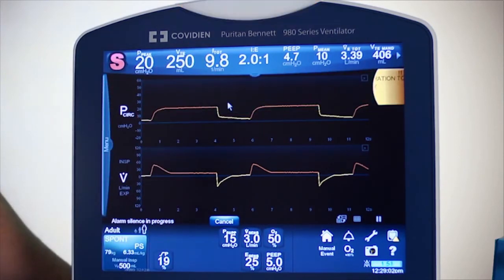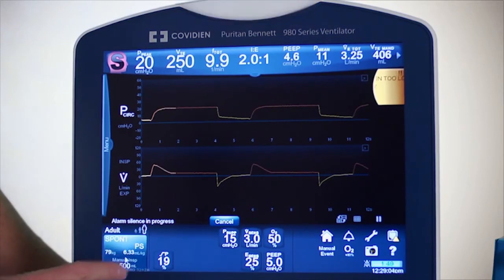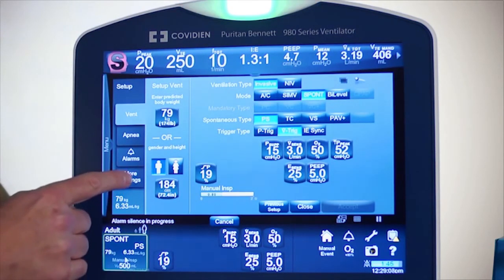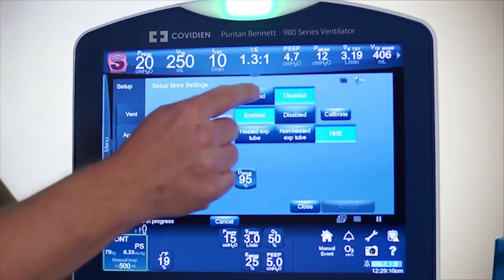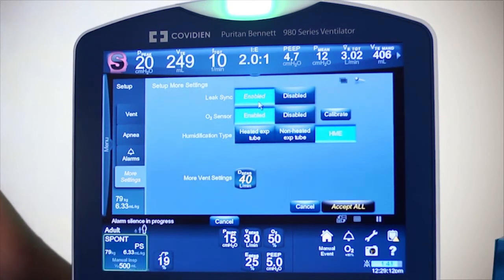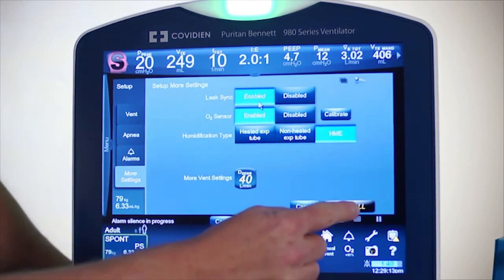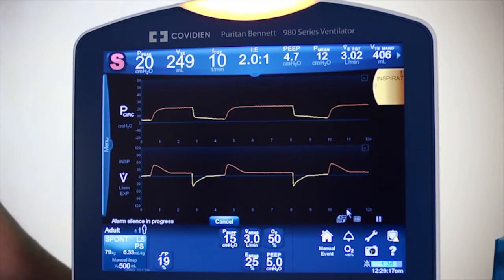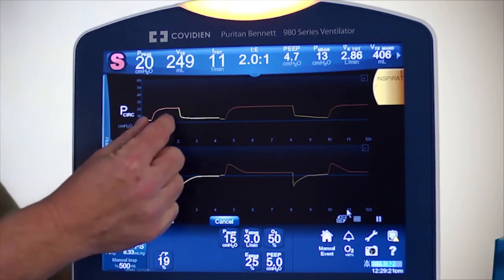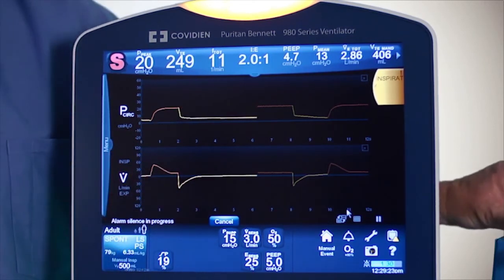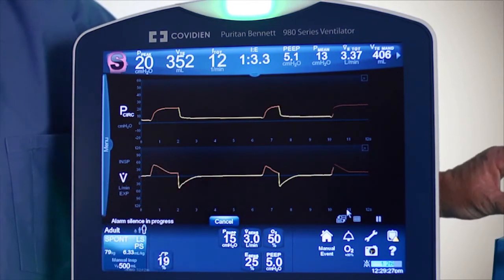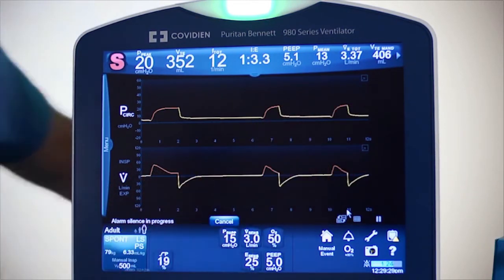Now I'm simply going to go into the LeakSync software under More Settings and turn it on, then Accept All. It will take a couple of breaths for it to recognize the leak. Once it captures it, you'll notice the time for the breath is much shorter — the machine is no longer auto-triggering and the cycling is no longer delayed.